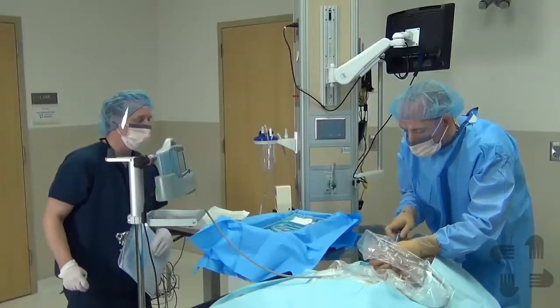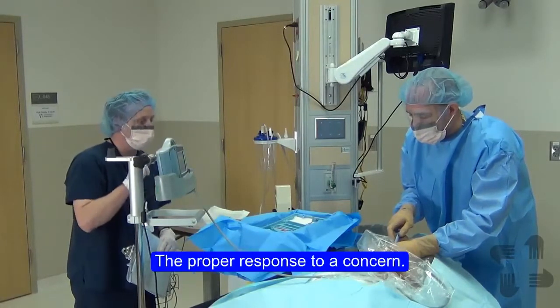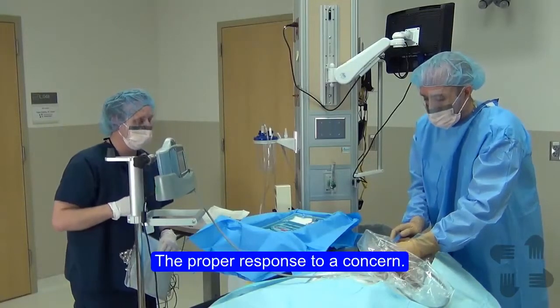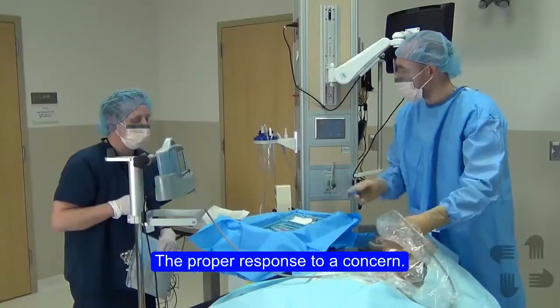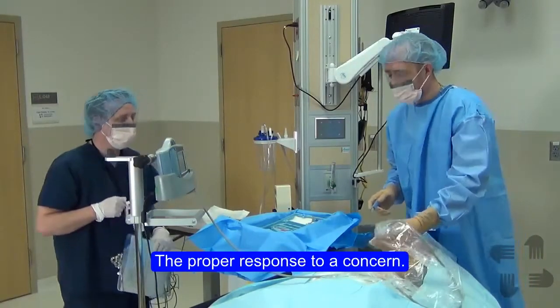Oh, hold on a minute, Travis. You just broke the sterile field. I'm concerned that you didn't notice that you broke the sterile field with the cord from the ultrasound laying on there. Yeah, you're right. Good catch. We should start all over, re-prep, get a new kit. We'll start from the beginning. Okay, thank you. Thanks, Trent.